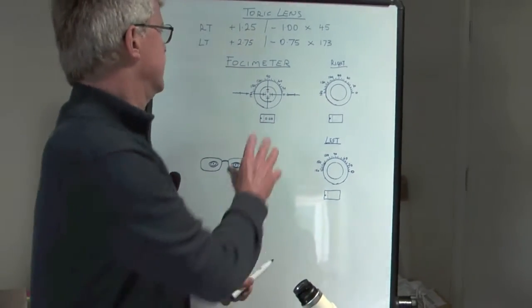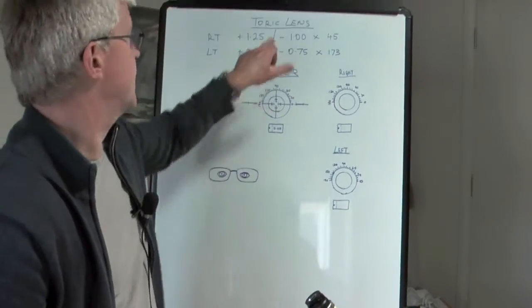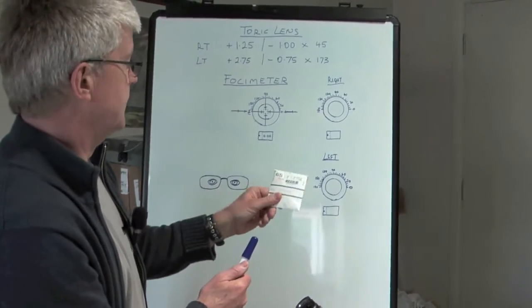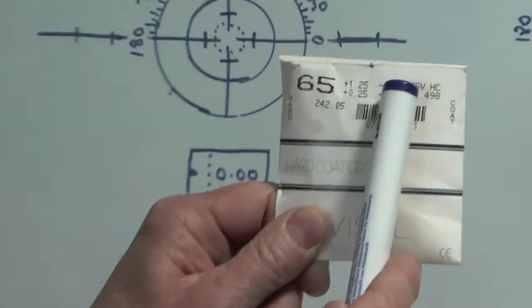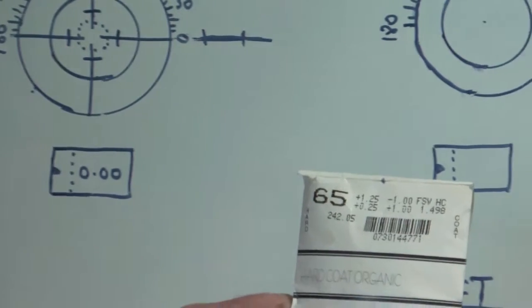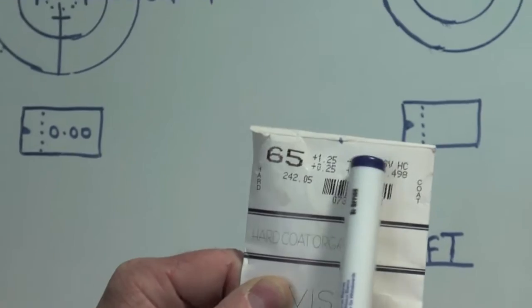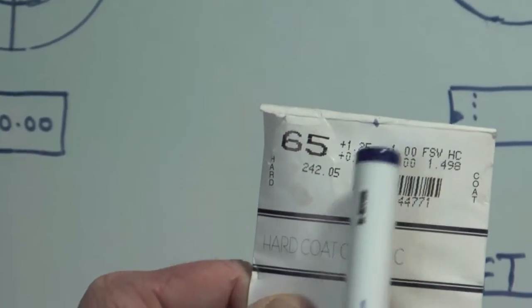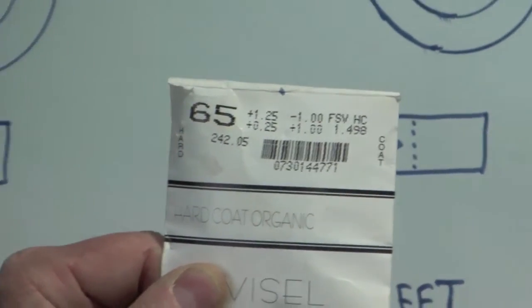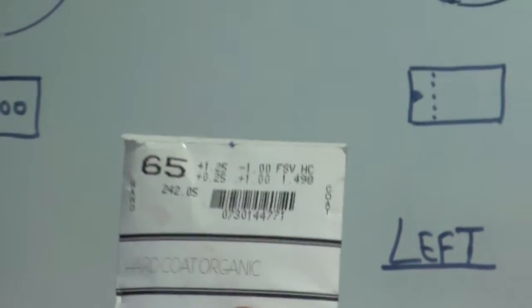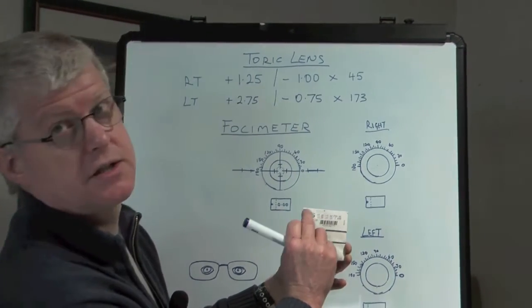There's no lens in there, but the focimeter is measuring plano at the moment. We then need to get the lens, and we're going to start with the right lens. We got plus 1.25 minus 1. Remember we were learning that you can write a toric lens in two different ways - minus cyl and plus cyl. I tend to work in minus cyl form.